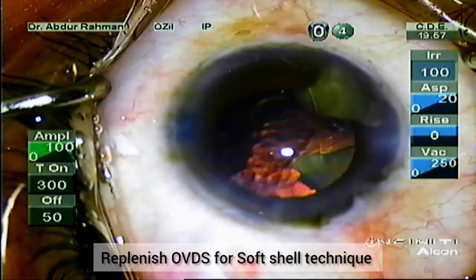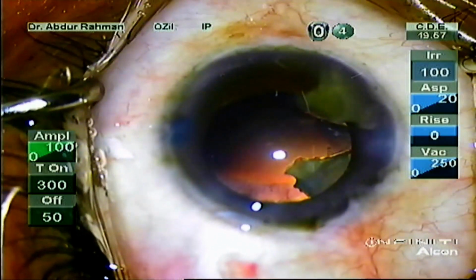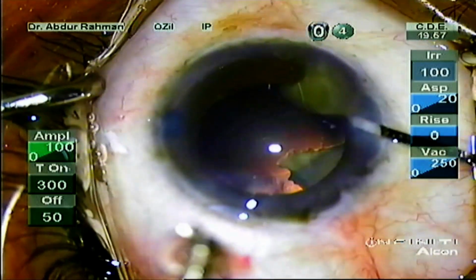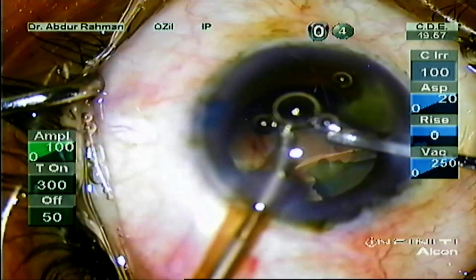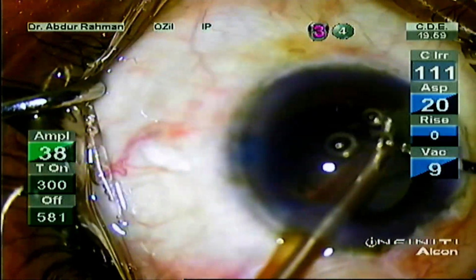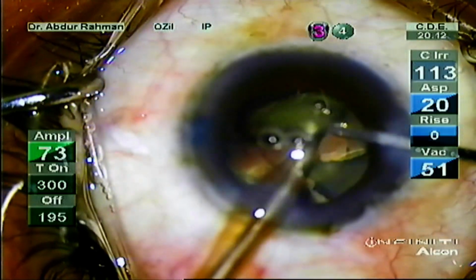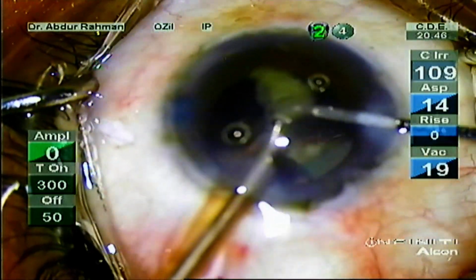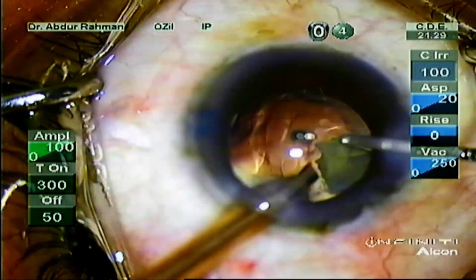Also, I am giving a dispersive and cohesive OVD to protect the endothelium and pushing the posterior capsule posteriorly. Remove the bubble before commencing with phacoemulsification, because this bubble might hamper the view during phacoemulsification of this small piece. You might not see the posterior capsule coming forward.